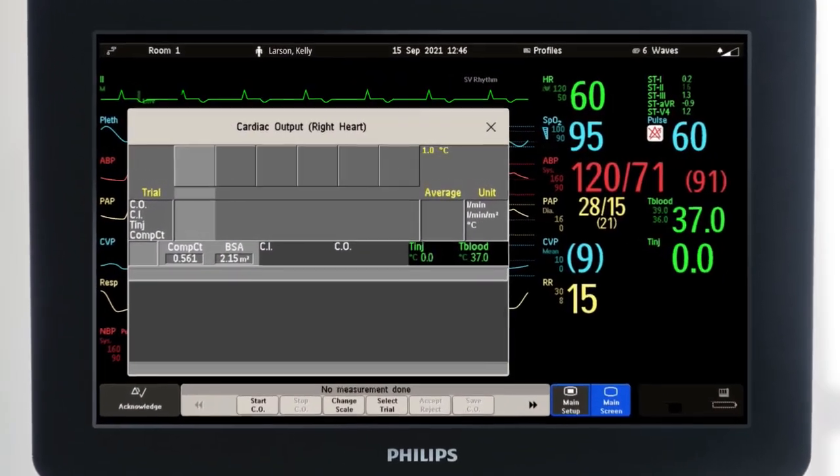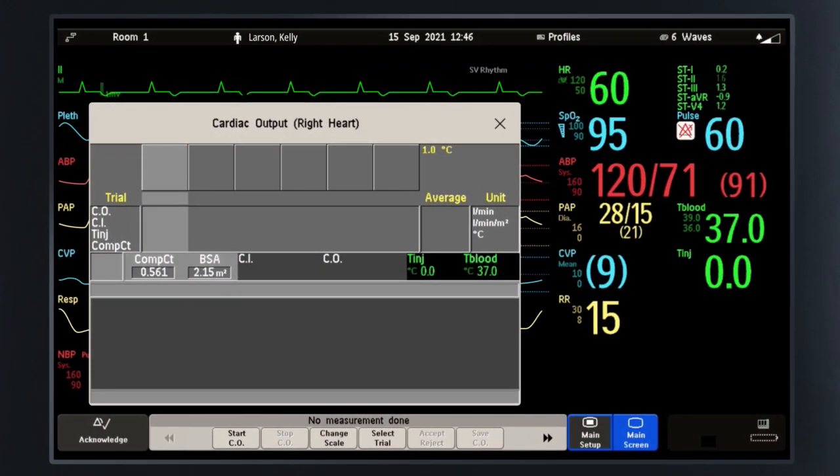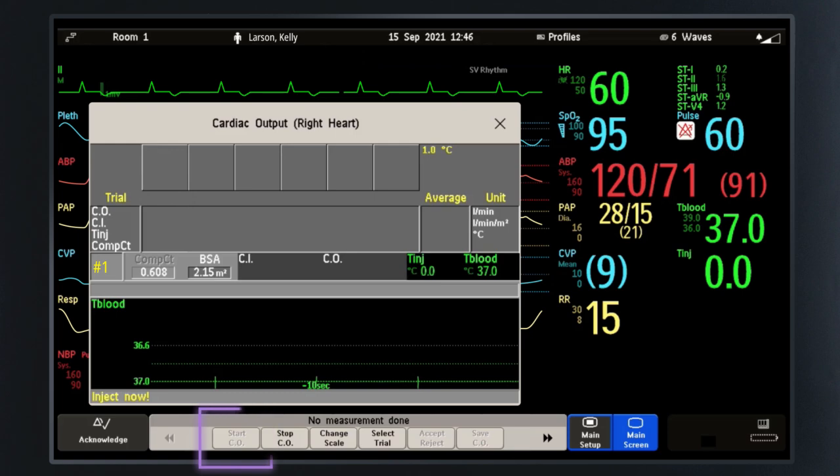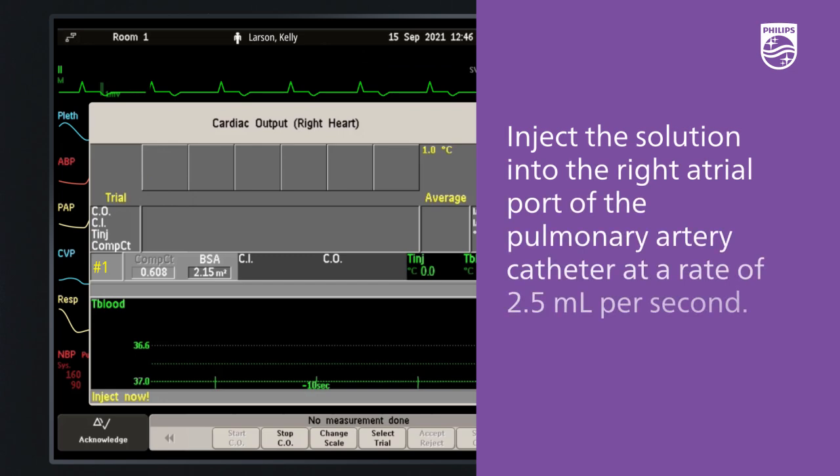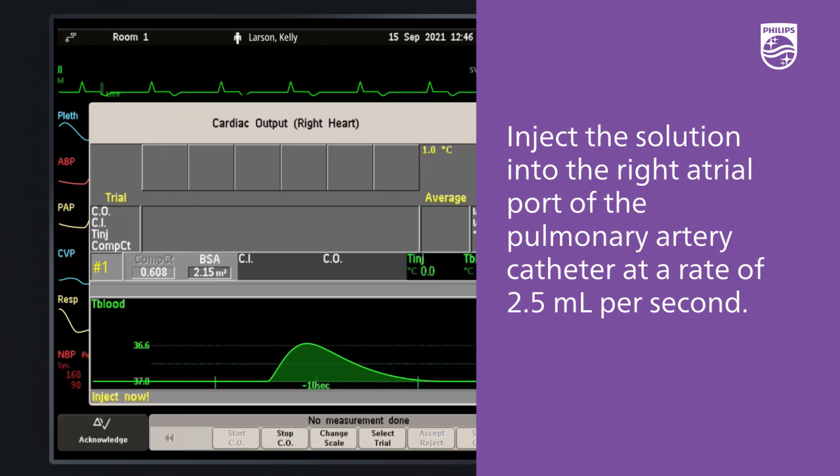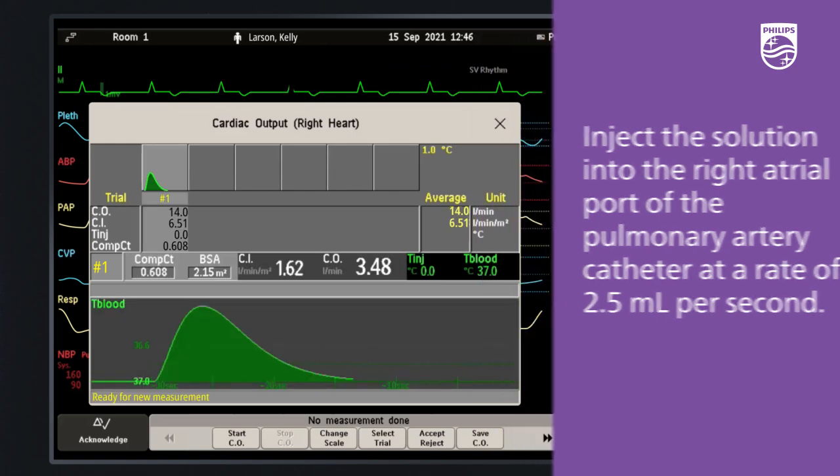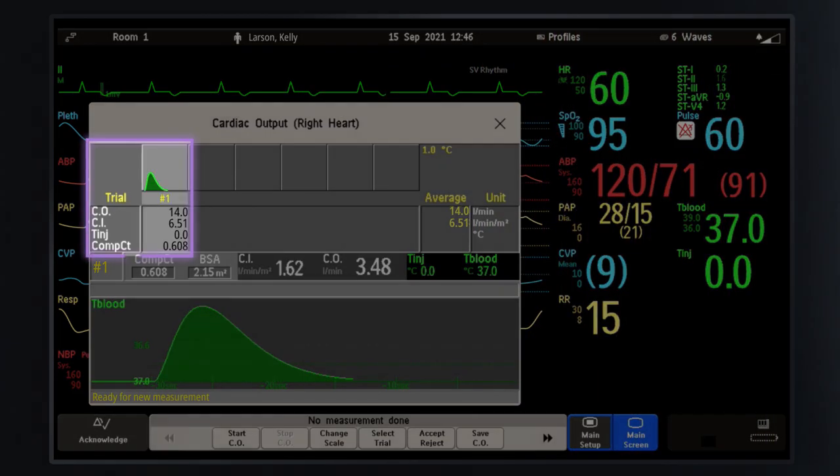From the cardiac output procedure window, select Start CO to start the first measurement. When you hear a ready tone and see the prompt 'Inject Now,' inject the solution into the right atrial port of the pulmonary artery catheter in a single constant manner at an optimal injection rate of 2.5 milliliters per second.